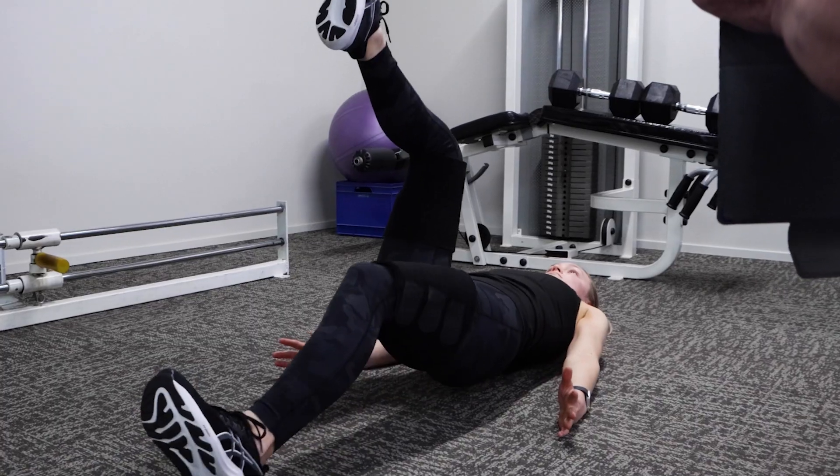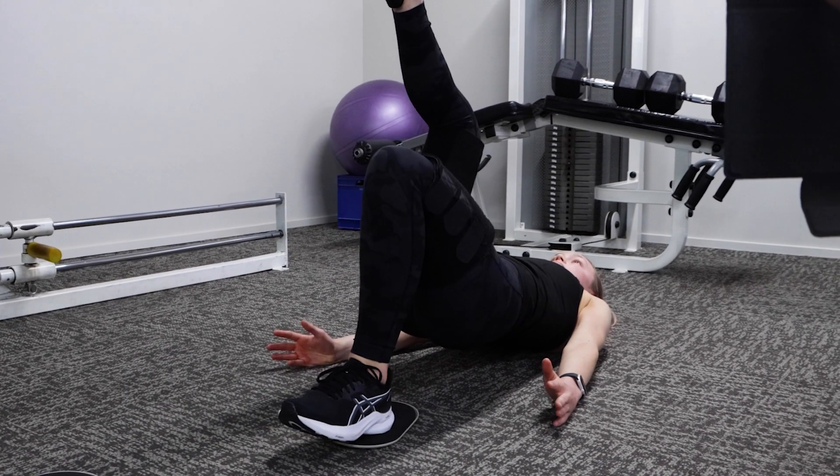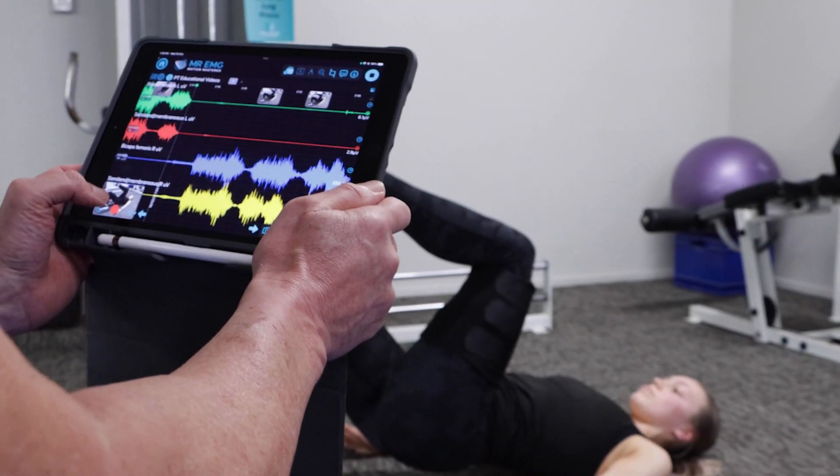Lastly we will test single leg hamstring sliders — five repetitions for each side, once again focusing on the same exercise tempo for each leg.